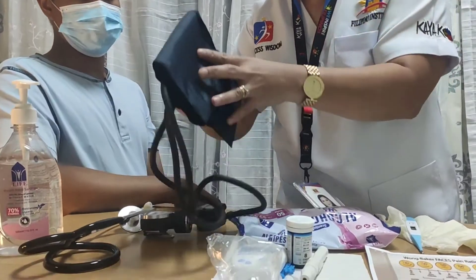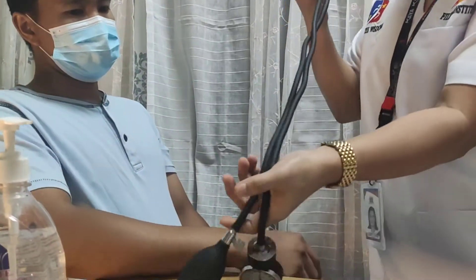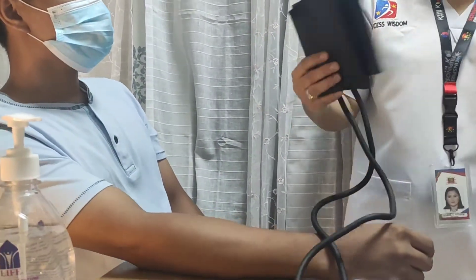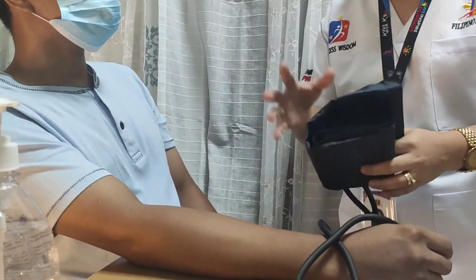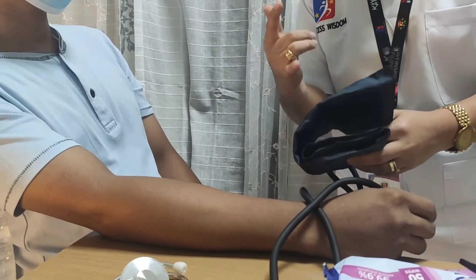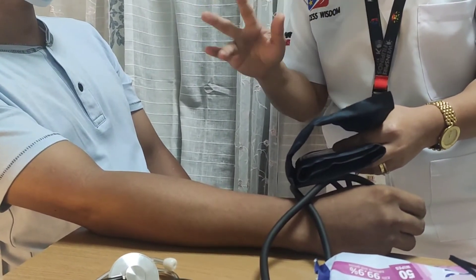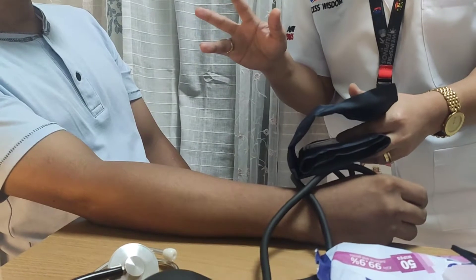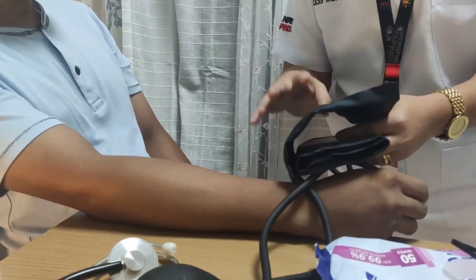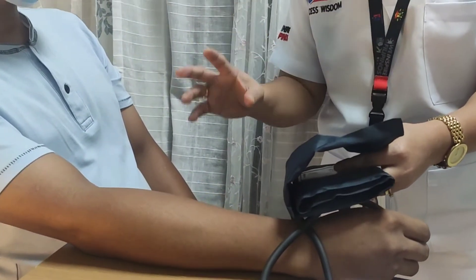To check the blood pressure using the sphygmomanometer, the following precautions must be considered before taking the BP: do not take the BP on the site of IV infusion, cast, dialysis access site, or breast surgery side. Ask the RN if not sure which arm to use. Allow the patient at least 20 minutes of rest before measurement.